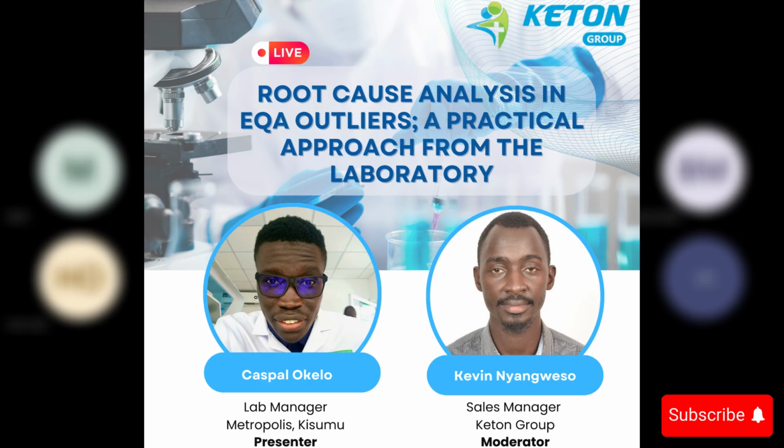Yes. In the machine for biochemistry, do we use calculated mean or reference mean? Stephen Otieno, in the machine for biochemistry, do we use calculated mean or reference mean? I'm trying to understand that Stephen is asking in regards to IQC, right? If it's in regards to IQC, it's always determined by the lab.